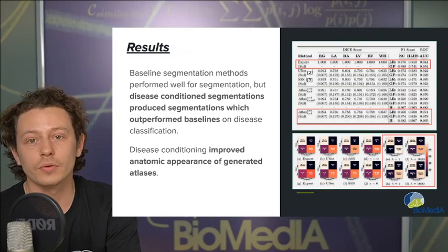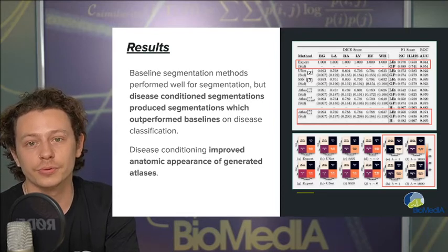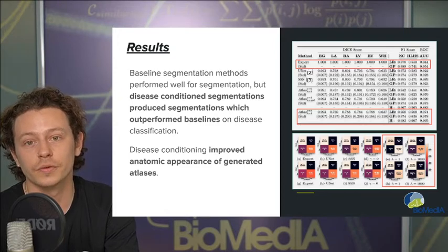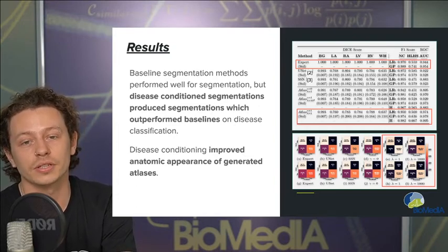We compare several methods for segmentation by average dice score achieved and show that each of the compared methods is effective for the segmentation of anatomical structures. But the question remains, which method produces the most informative segmentation for downstream disease diagnostics? Our area ratios classification method achieves state-of-the-art performance for HLHS classification over previous classification methods, and the performance of area ratios extracted from automated segmentations is on par with those extracted from expert manual segmentations.